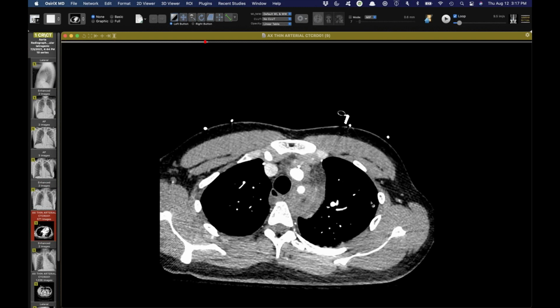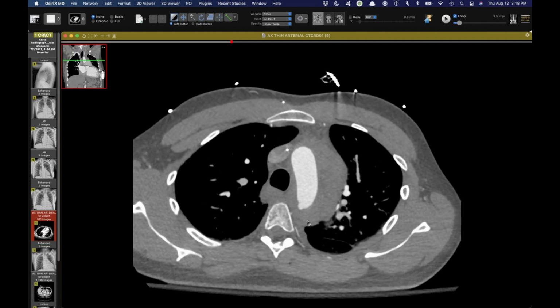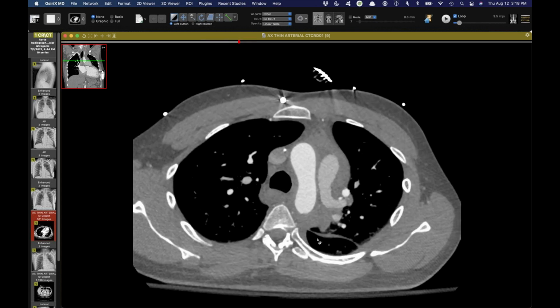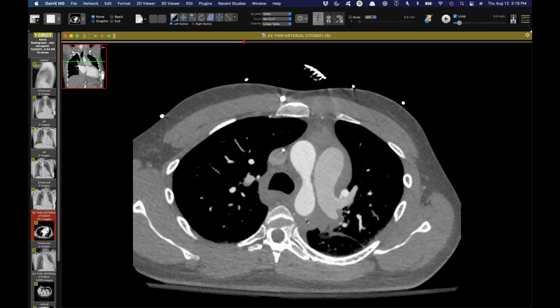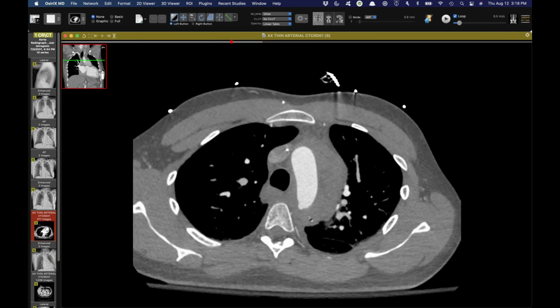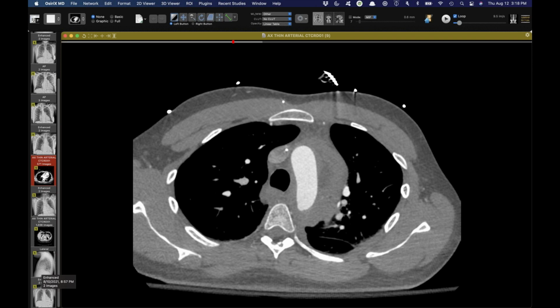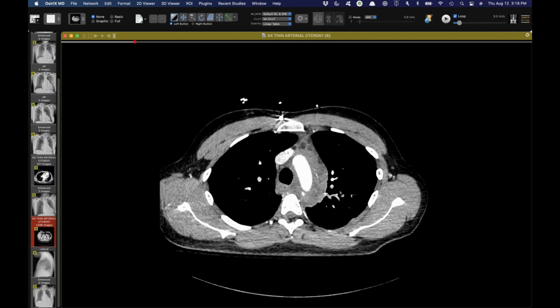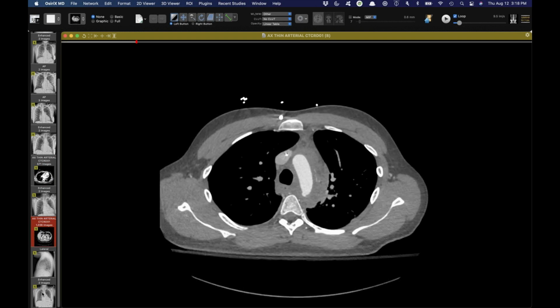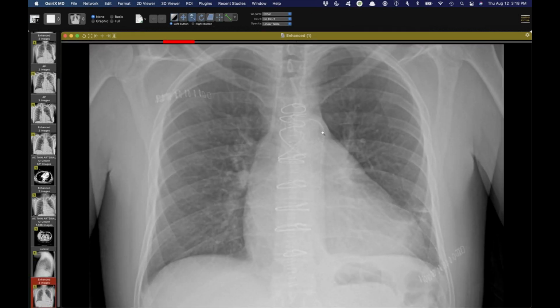And you can see there's hematoma surrounding the aorta, and there's a tiny little hole right here, which is not like a little branch artery pseudoaneurysm or feeding any sort of intercostal. Presumably that's where the intra-aortic balloon pump must have dissected or essentially ruptured the wall of the aorta, because you can see this hematoma. I have not seen this as a complication before, but this is iatrogenic aortic injury with a considerable amount of blood surrounding it. Wow. I think they did a follow-up a couple days later, and you can see it's still there, still has that same little outpouching. Then this guy actually got a heart transplant, but before they did that, they put a stent. And as you can see now, the mediastinal hematoma has resolved and the mediastinal interfaces are back to normal.